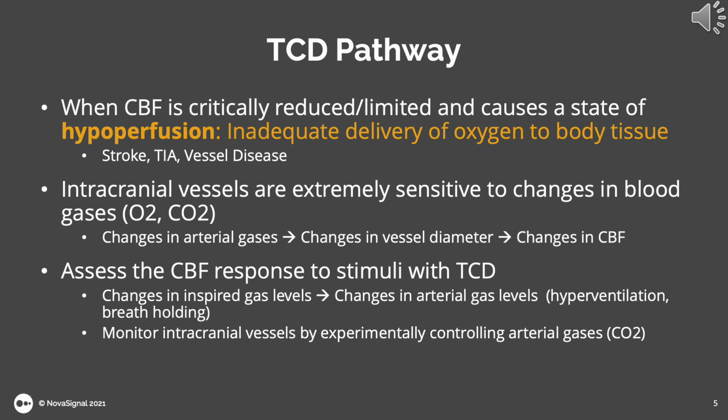Changes in inspired gas levels, so the air you are breathing in, cause changes in arterial gas levels. Examples would be hyperventilation, where you're taking in more oxygen, and breath holding, where you're retaining CO2. We can experimentally control arterial gases such as CO2 levels and monitor the intracranial vessel's response with TCD.